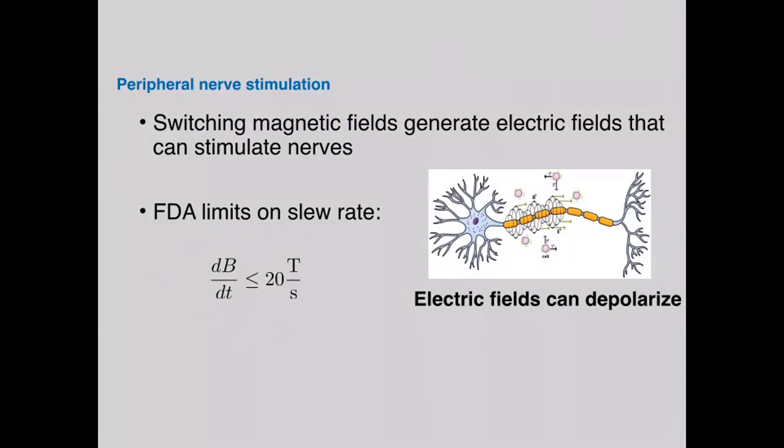But often, people will model this, or they'll perform experiments with different sequences that have those switches, such that you make sure that you don't stimulate peripheral nerves. And with some scanners, the gradients are so strong that you can actually create not even peripheral stimulation.